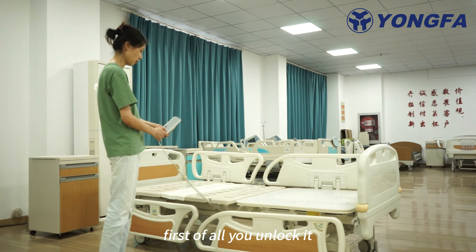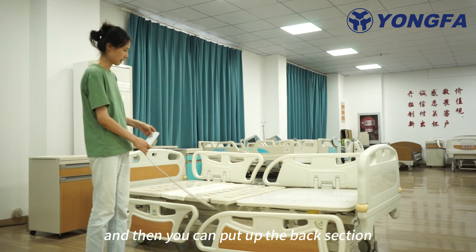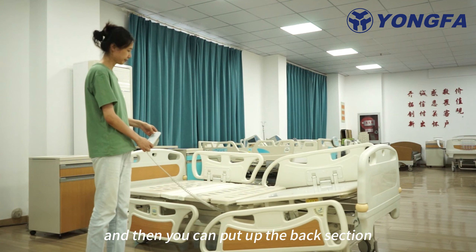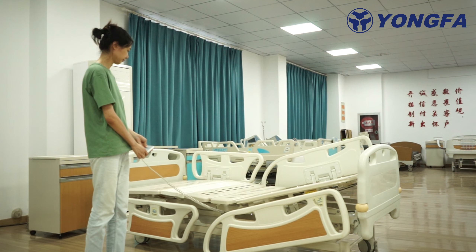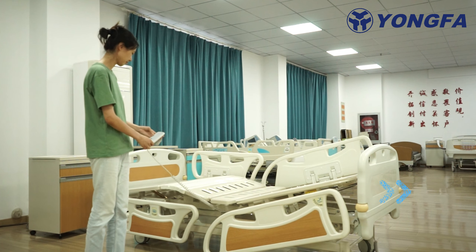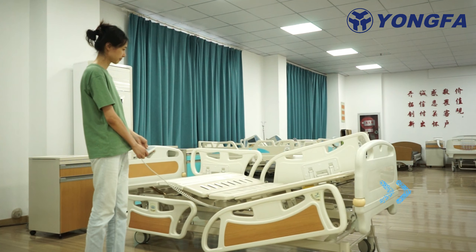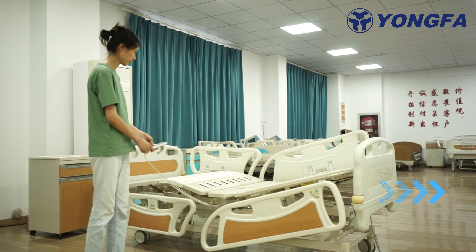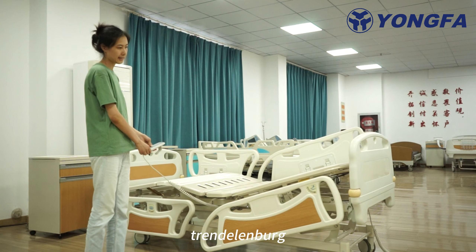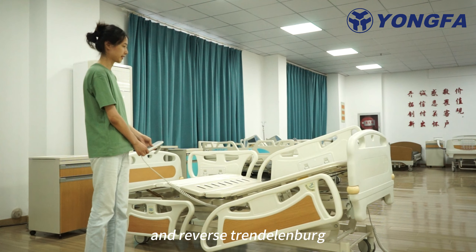First of all, you unlock it. And then you can put out the back section, the knee section, height adjustment, Trendelenburg and reverse Trendelenburg.